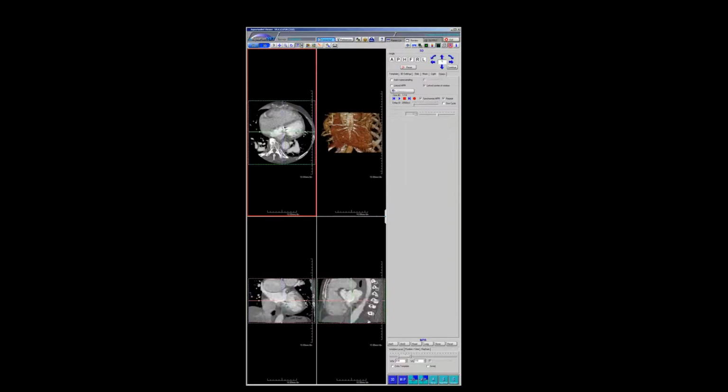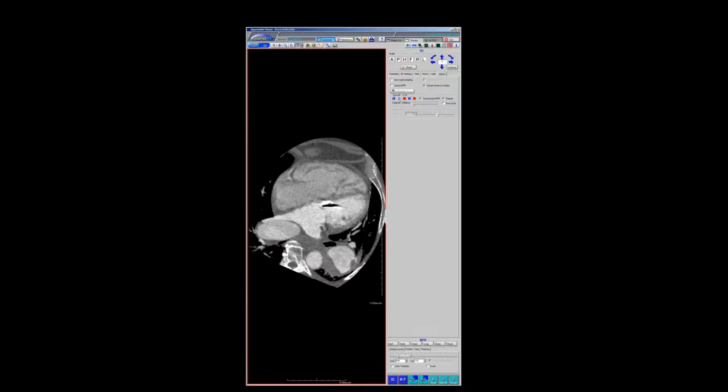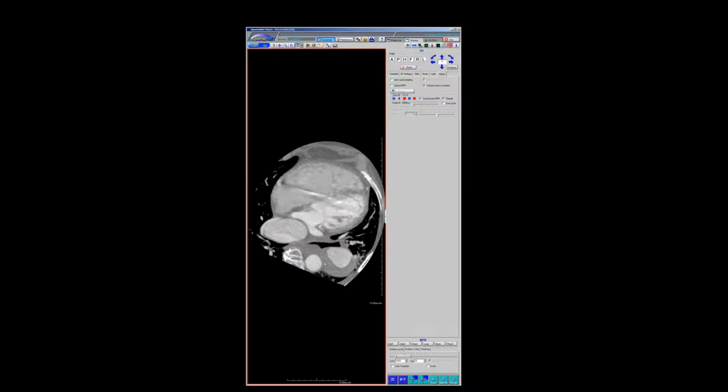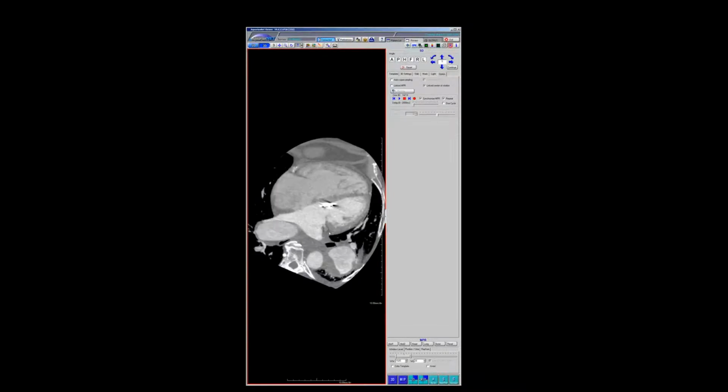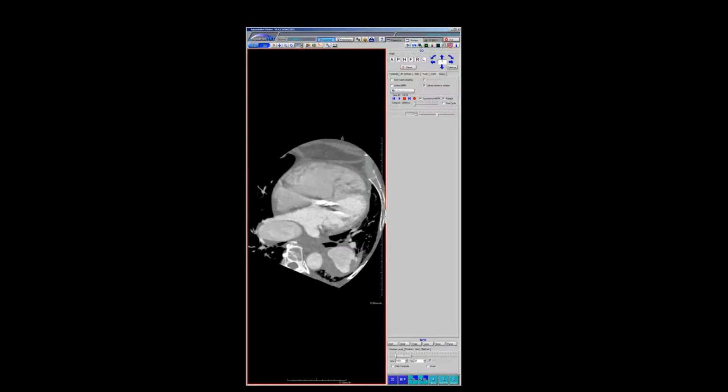This is just an interesting case that was done last night. I don't know why there's so many phases, but this is a patient who clearly has pulmonary hypertension and has very nice findings of pulmonary hypertension. And what's interesting here is has this in situ thrombus, which we see, and you can see the huge, they want to assess the coronaries in this patient.